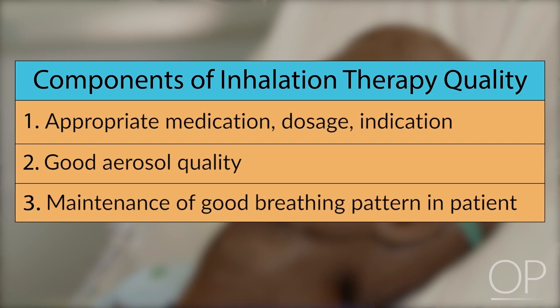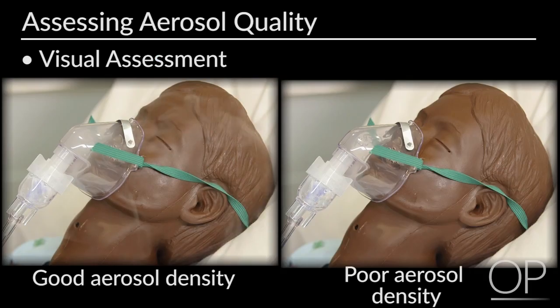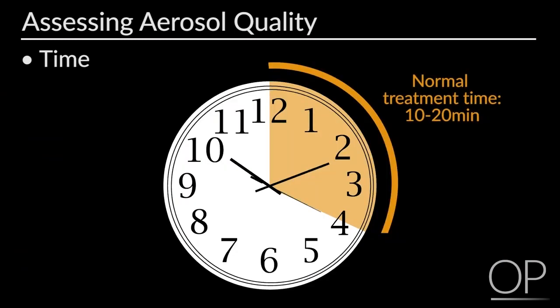Aerosol quality can be assessed a couple of different ways. First, a visual assessment of the aerosol density can be done. Here, you note both good and poor aerosol quality. Second, the time that is required to complete aerosolization of a prescribed medication volume should be noted. If the time is much too short or too long, a problem with delivery may have occurred.